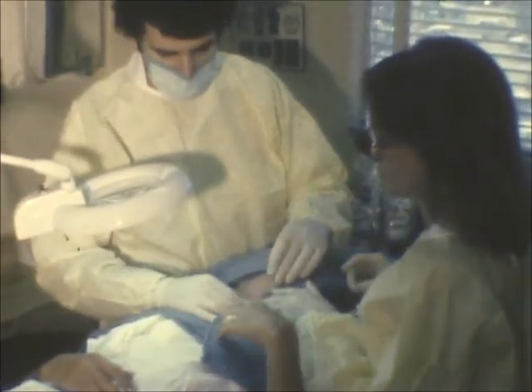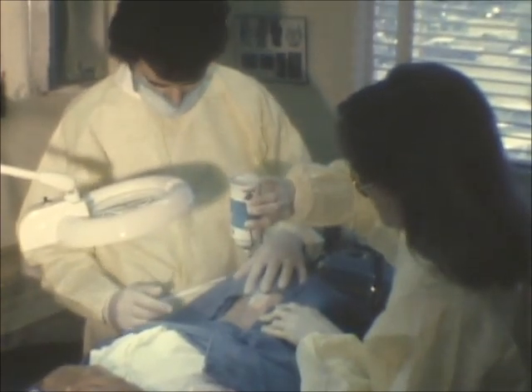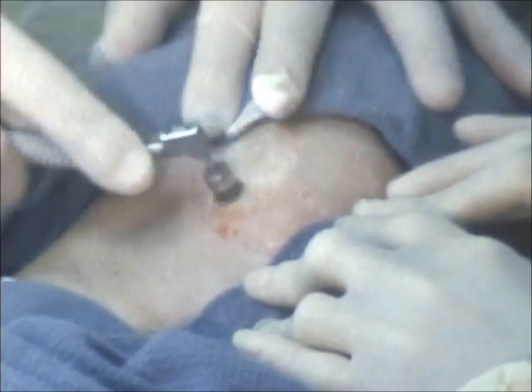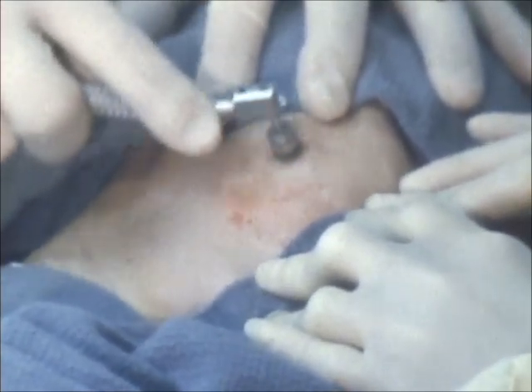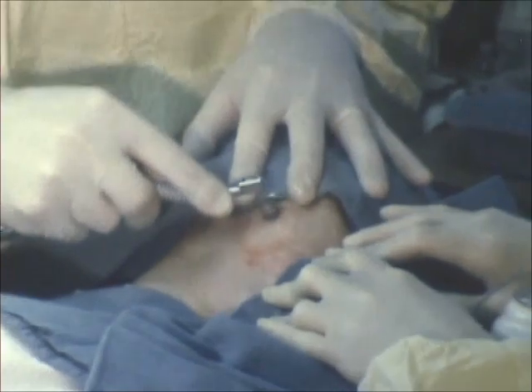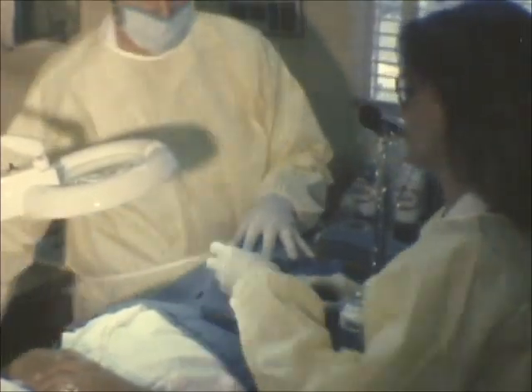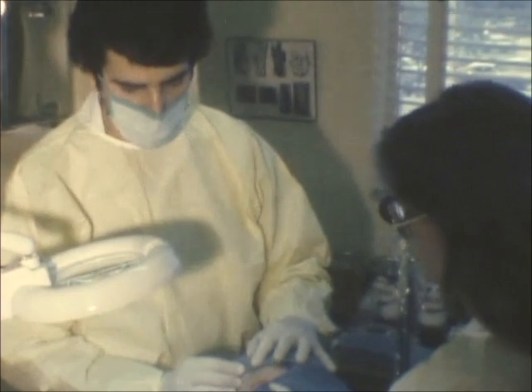The patient should try not to touch the face. We abrade into the adjacent area. This is usually not painful — it just stings slightly. The longer the freeze, the harder the surface, the deeper the cut may be, depending upon the pressure of the brush.